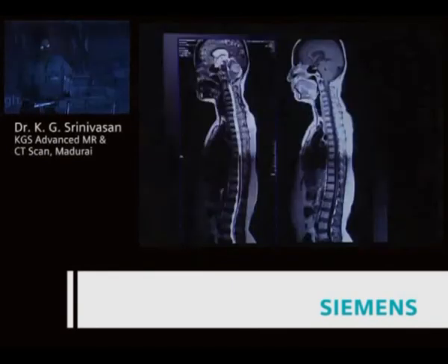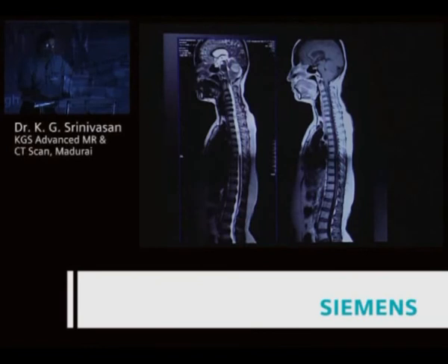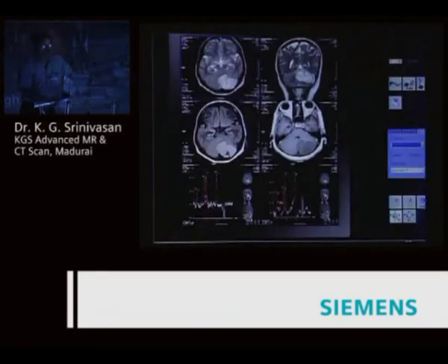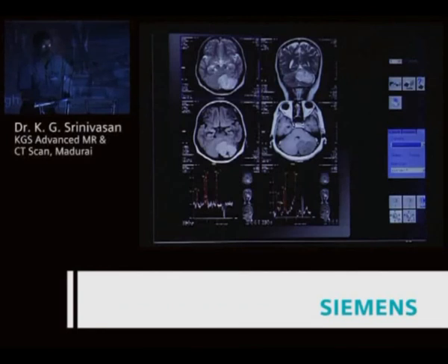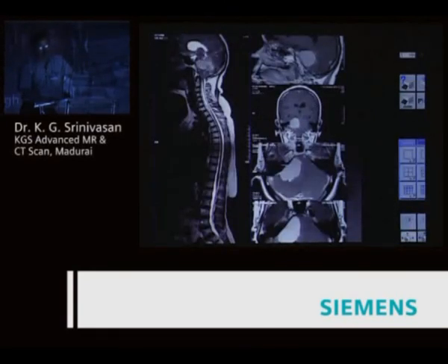Patient with history of syringomyelia — a cervical pathology is established — but carefully looking above, you can see a lesion in the cerebellum with the classical corduroy pattern. It produces less mass effect, and spectroscopy does not show much elevation. This is a case of dysplastic gangliocytoma of the cerebellum, so-called Lhermitte-Duclos disease — usually benign, but causing fourth ventricular outflow obstruction producing syrinx-like symptoms.